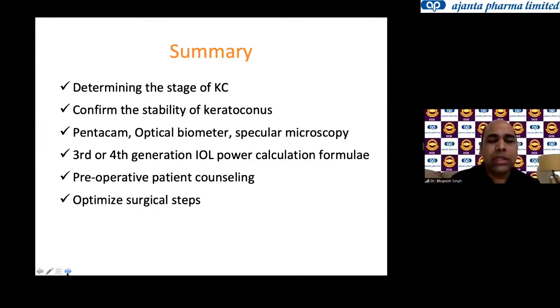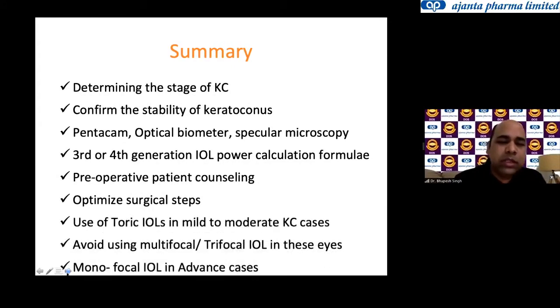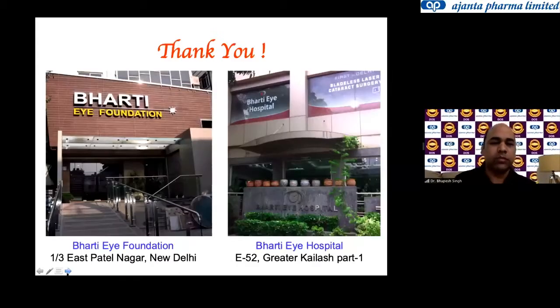We also have to optimize the surgical steps that I've already discussed. The use of toric IOLs in mild to moderate cases can be done. We should avoid using multifocal or trifocal IOLs in these eyes, although monofocal IOLs work very well in advanced cases. Thank you.